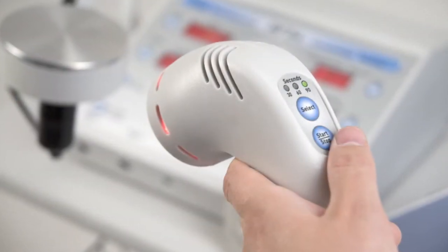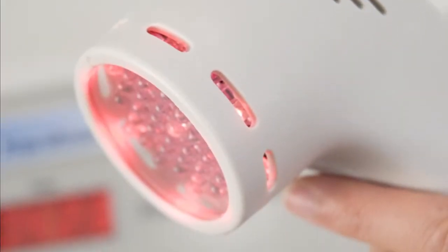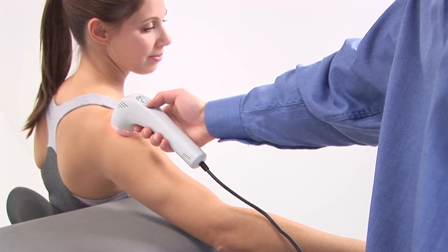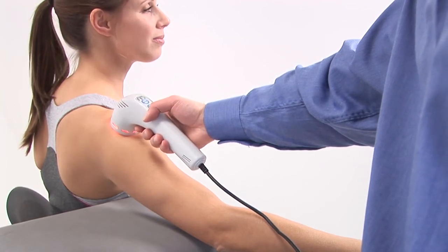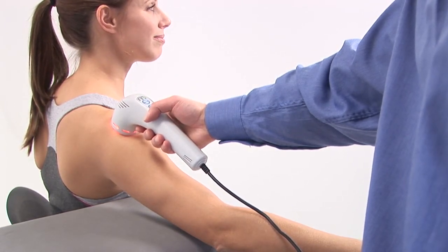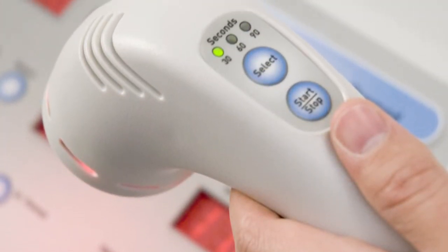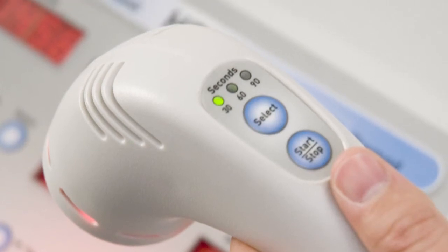The Horizon is versatile and can be added to the HF54 or used as a standalone unit. The Horizon Infrared and Red Light Therapy Unit delivers a powerful 800 mW of infrared and red light with 36 infrared and 7 visible red superluminous diodes. The light head comes with three time settings and should be placed directly on the skin. The Horizon's infrared light has been proven to absorb into the body's cells, transforming that energy into adenosine triphosphate — the form of energy that cells utilize for healing.